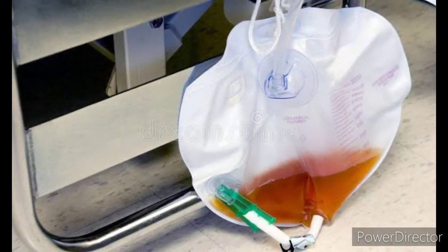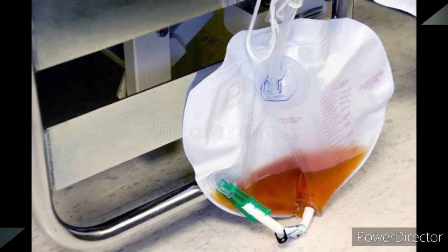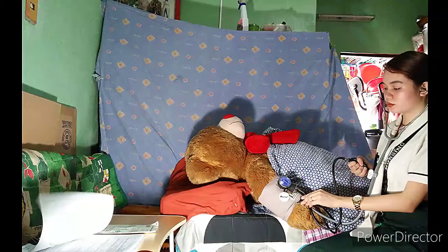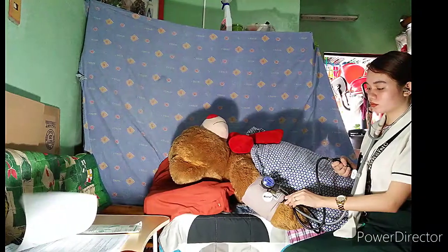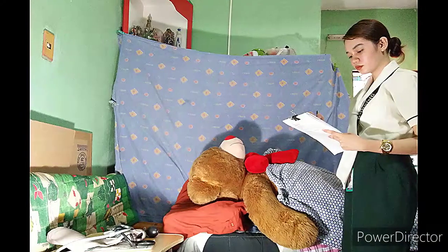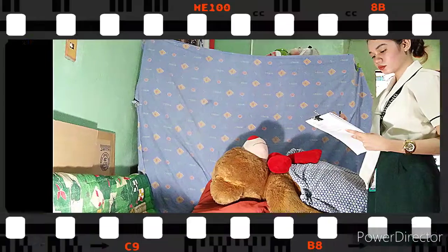Connect the drainage port of the catheter to the fluid collecting bag to monitor for the amount of blood loss. After the procedure, I will remove my gloves and wash my hands. Continue to monitor the vital signs, urine output, fundal height, vaginal bleeding, and amount of blood loss to monitor if the client is experiencing hypovolemic shock. Document the procedure on the nurse's notes. If the bleeding did not subside, you need to refer the client to a CEMONC facility.